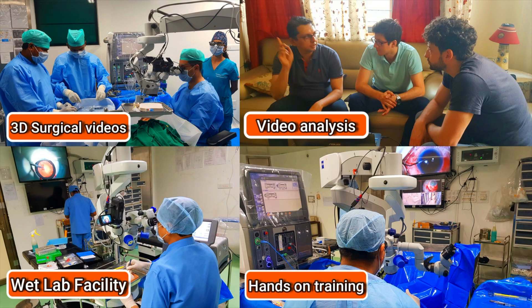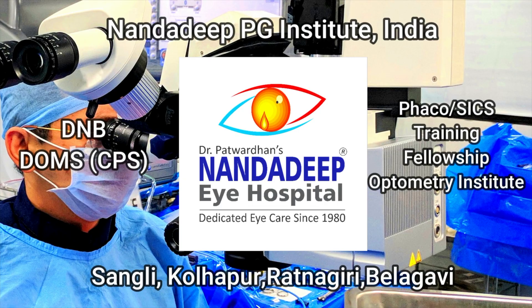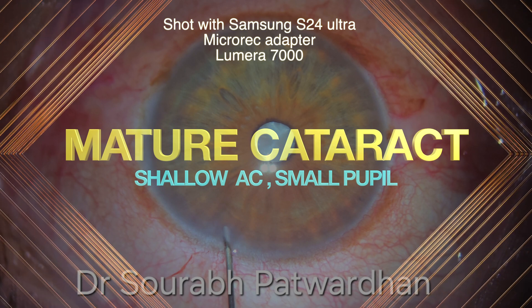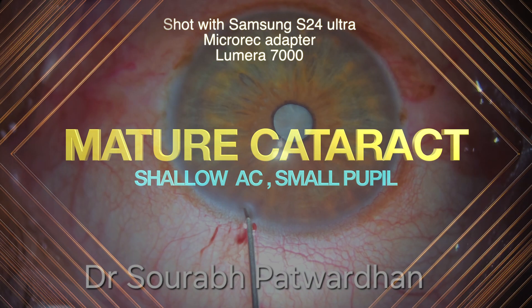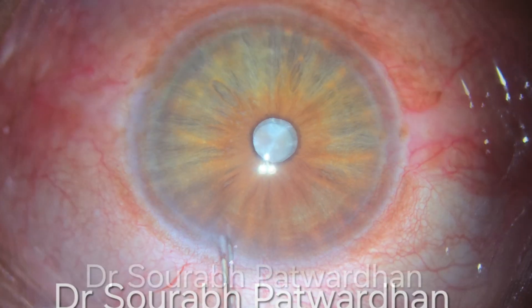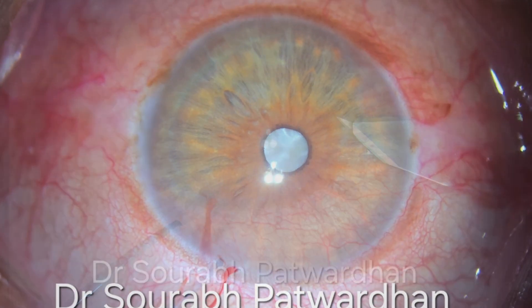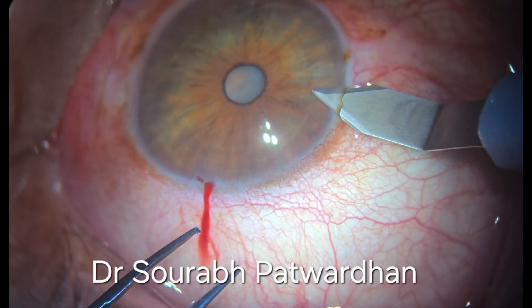In our center, we have a lot of teaching activities which includes hands-on training as well. This particular surgical video was shot with Samsung S24 Ultra with Microrec adapter and I am doing surgery on Lumera 700 microscope and this is a mature cataract.